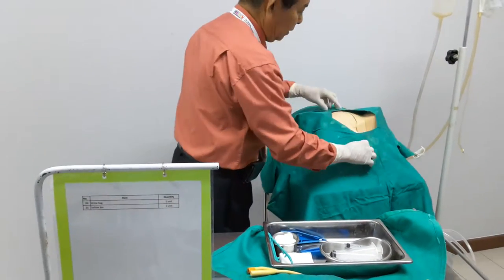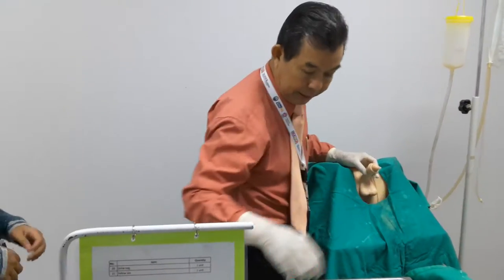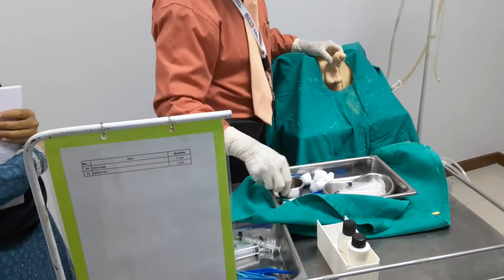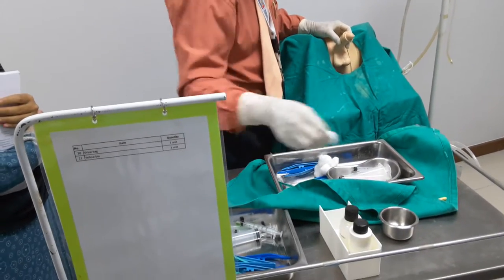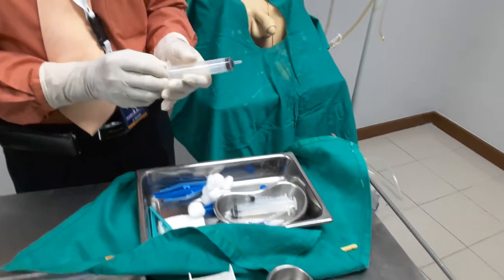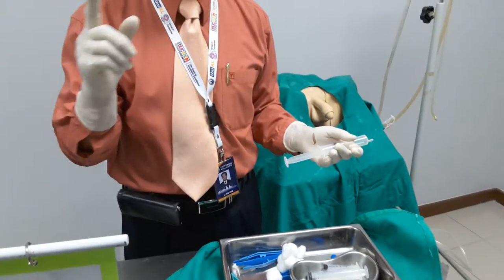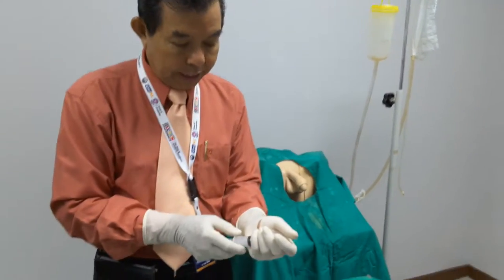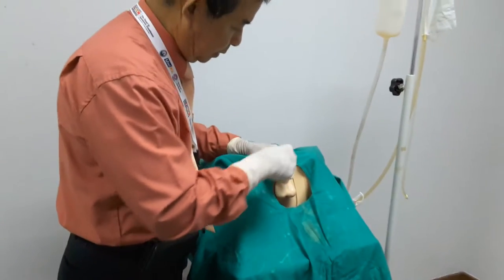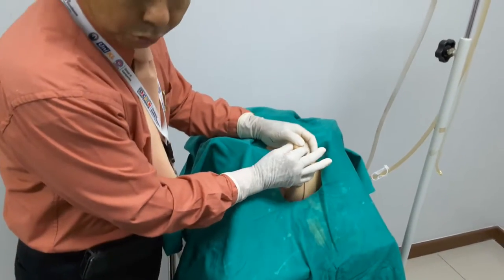Now I can hold with my left hand and apply lubricant. In the real clinical setting, we use anesthetic gel. We draw about 5 to 7 cc from the tube and then pump it into the urethra. Stop and clamp with a stopper so the anesthetic gel stays inside.